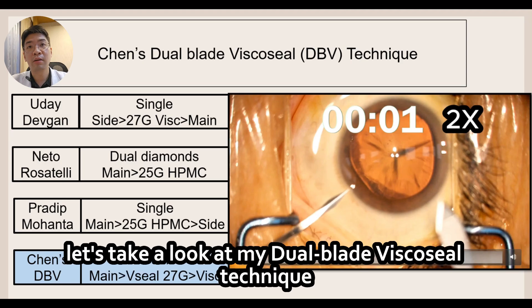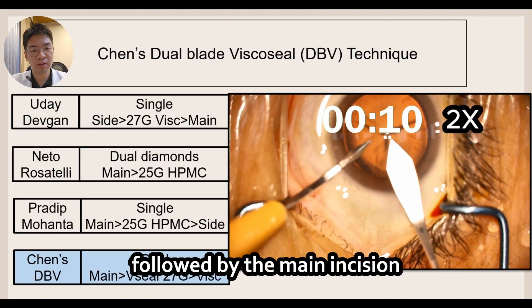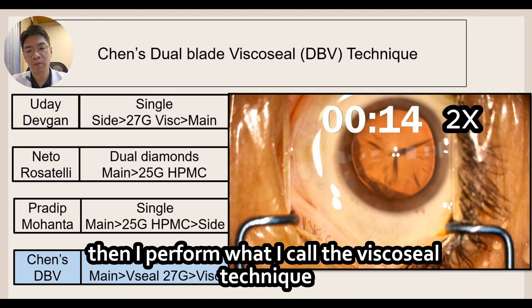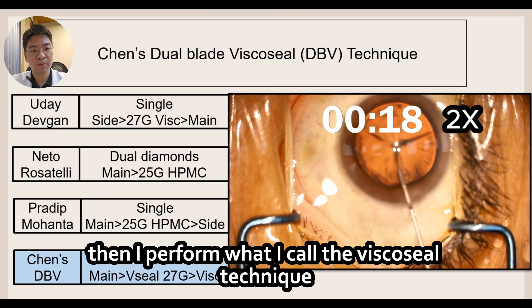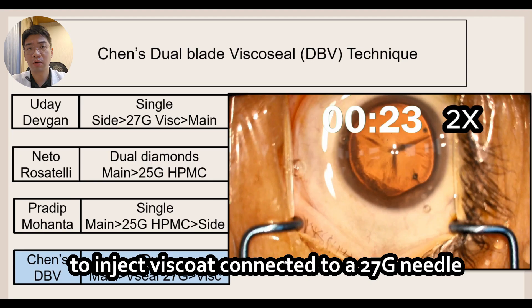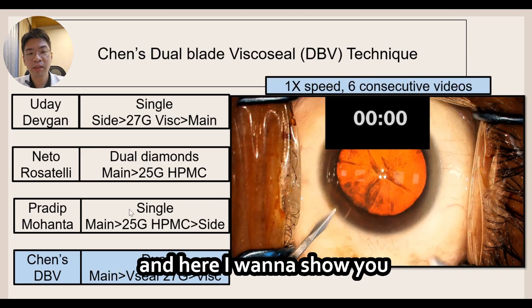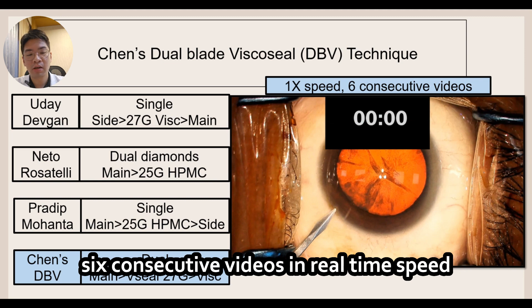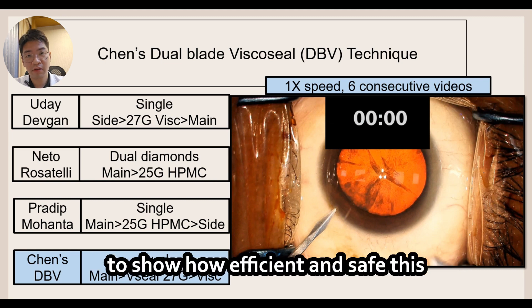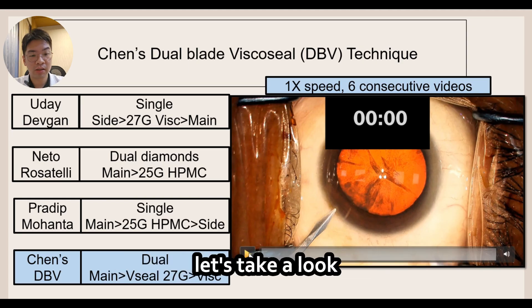Now let's take a look at my dual blade visco seal technique. I first create the side port incision followed by the main incision, and then I perform the visco seal technique before I enter the anterior chamber to inject visco connected to a 27 gauge needle. Here I want to show you six consecutive videos in real time to demonstrate how efficient and safe this dual blade visco seal technique is.